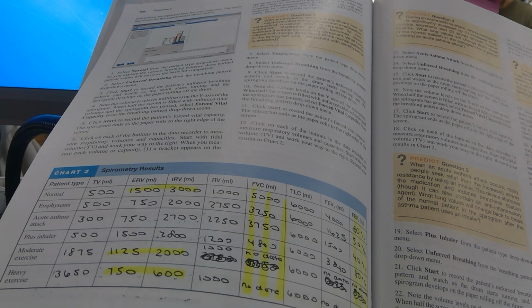And then the patient with emphysema, notice that the amount of air they can forcibly breathe out was almost reached, well, it wasn't quite in half, but it was 3,250 milliliters. So it was drastically cut down compared to 5 liters. And their FEV1% was down to about 50%. That is a diagnostic test that says this person has an obstructive disorder. That is what we use to diagnose an obstructive disorder.